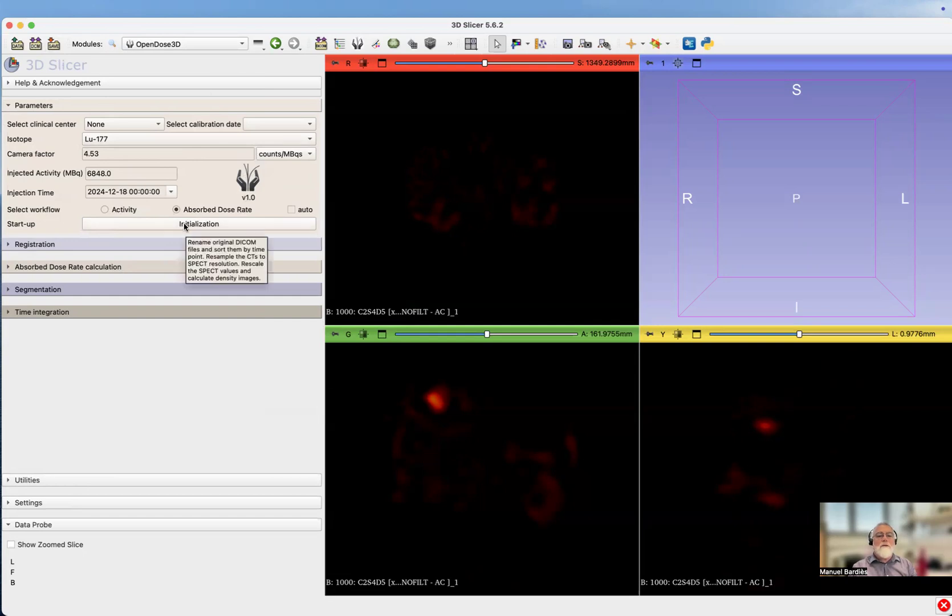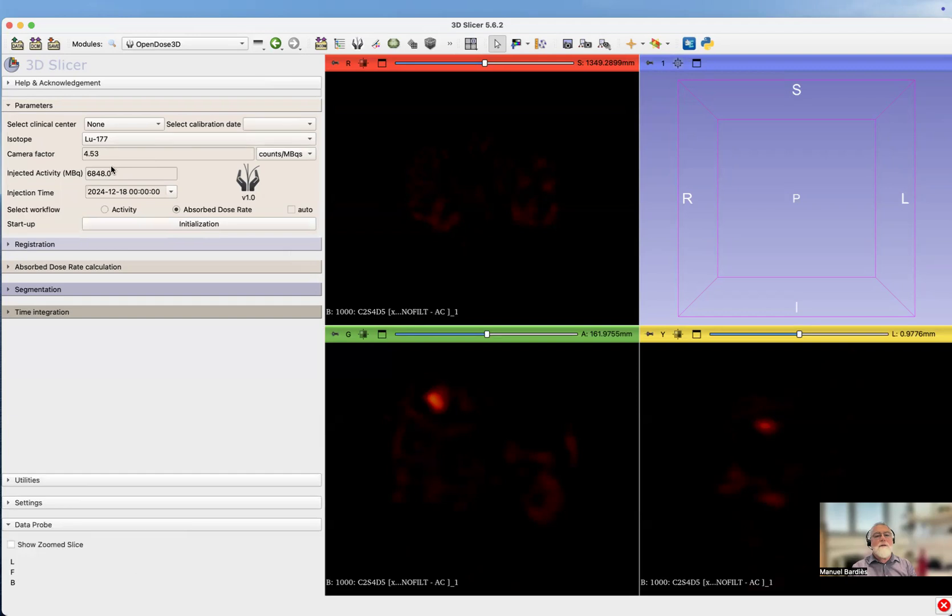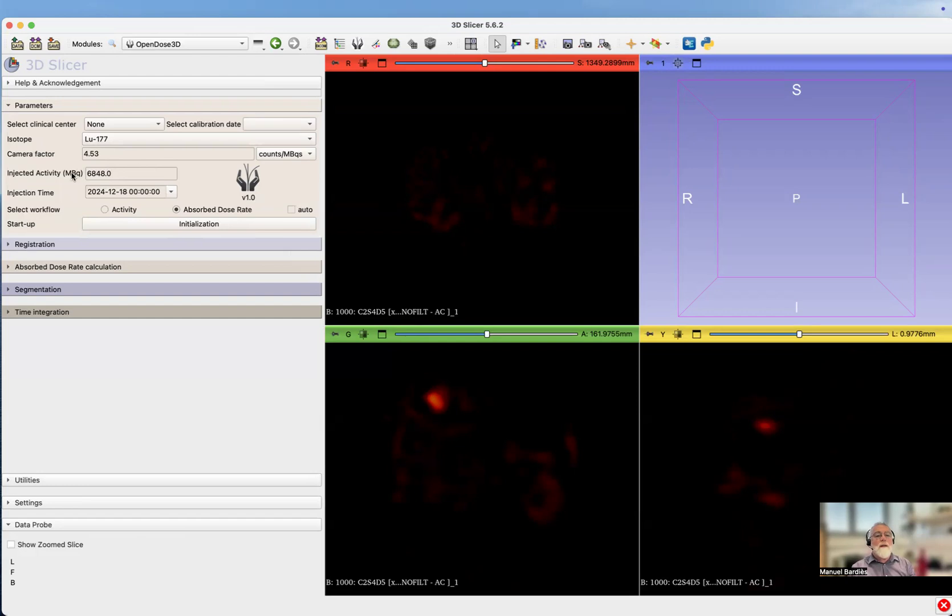We need to launch the initialization. We have by default the right isotope, but it doesn't really matter because when we do the initialization, it's going to check which isotope this is. You can see here we have a default camera sensitivity factor. It's not a good one because these are quantified images. That's going to be informed automatically, and so should the administered activity and the injection time.